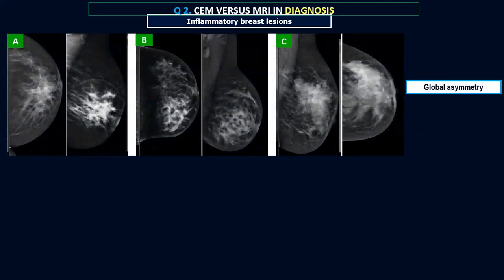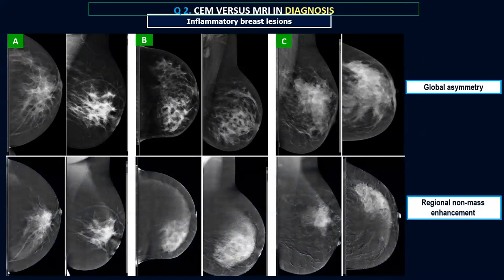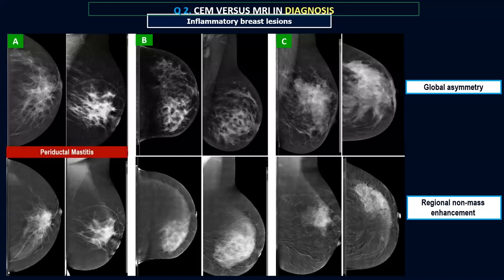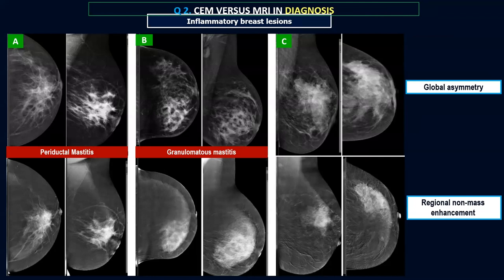Another limitation of contrast mammography is its use with inflammatory breast lesions. Three different cases each had a global asymmetry of the left breast with parenchymal distortions. In all three, contrast mammography showed regional heterogeneous non-mass enhancement in a similar pattern. But on biopsy, the first was periductal mastitis — treated with simple antibiotics — the second was granulomatous mastitis, treated with cortisone and immunosuppressive drugs and very resistant to treatment, and the third was an actual invasive duct carcinoma. Whenever a patient presents with inflammatory breast symptoms, do not perform contrast mammography because it will always give false positive results — it is better to perform MRI.